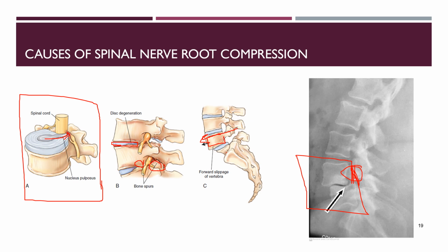But I've had some experiences in the clinical setting where the supervising PT wanted them to perform mechanical traction. They had something similar to this image on the right here, and they did not respond very well to it. So again, personal experience plus just knowing that this is spinal instability, it didn't seem appropriate to me to do it.